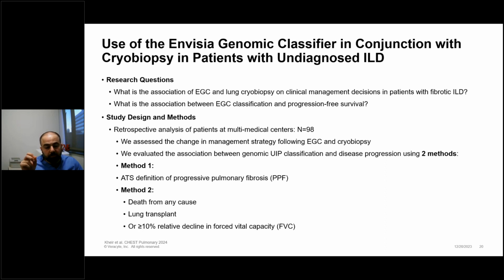This was a retrospective study in 3 medical centers. And as we said, we assessed the change in management strategy following both genomic classifier and cryobiopsy. And also we evaluated the association between genomic UIP classification and disease progression.